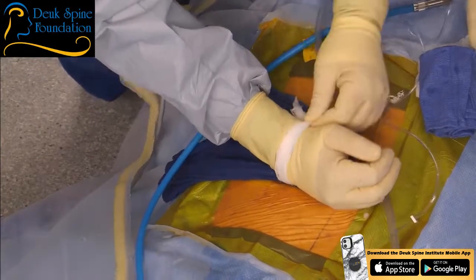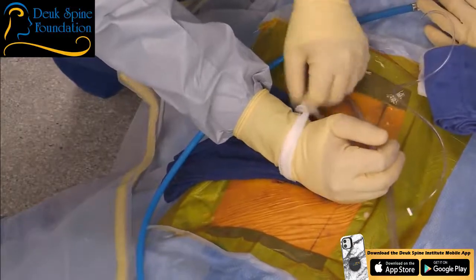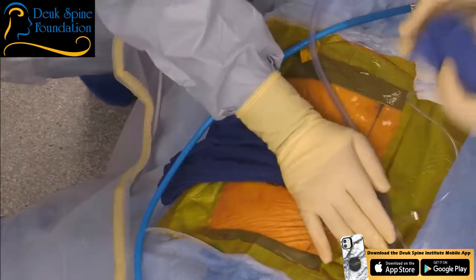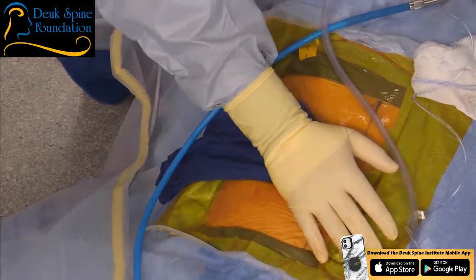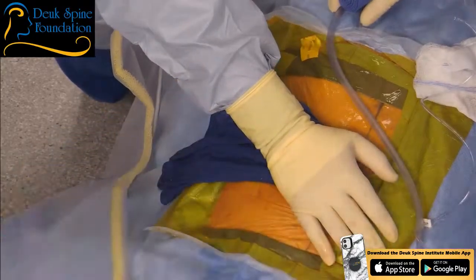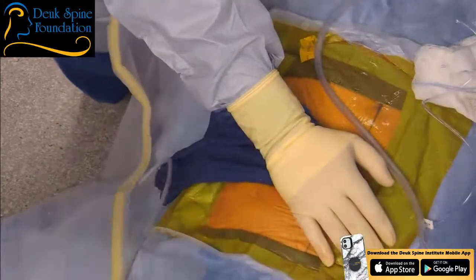The audience had a question about the lack of dye during the procedure. That's a great question, and I'm glad you noticed that. Remember when we did the discogram? Go back and rewind, and you'll see there's almost a cotton ball of dye in the middle of the disc, and it really didn't go through a tear to the outside. Well, that's why the tear was white today.